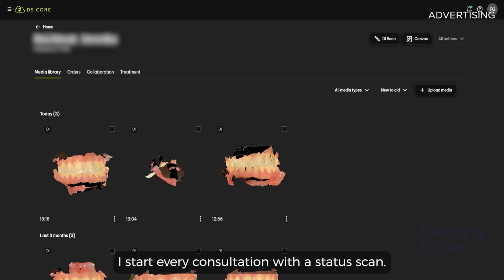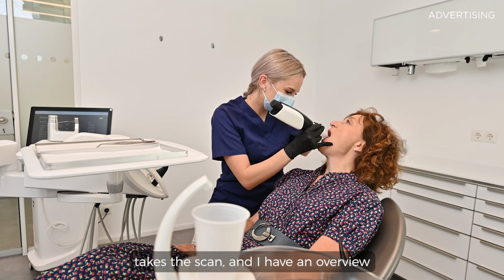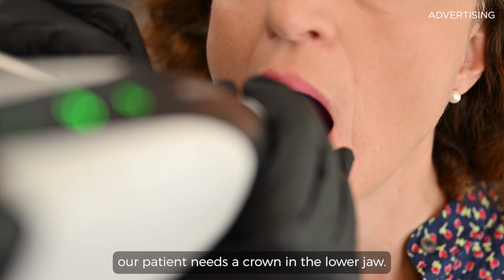I start every consultation with a status scan. My assistant takes the scan, and I have an overview about the oral health of my patient. In this case, our patient needs a crown in the lower jaw.